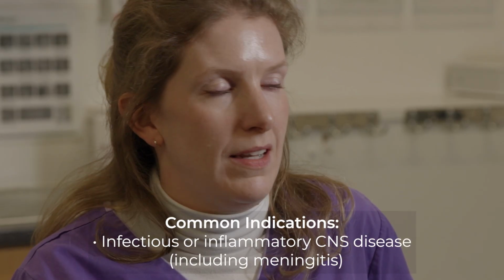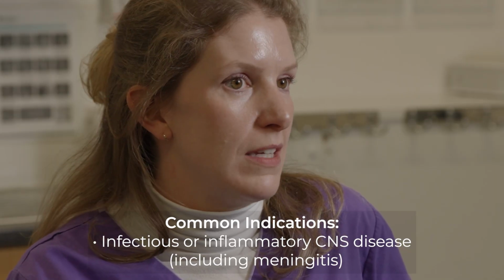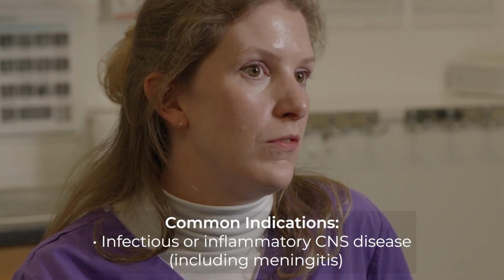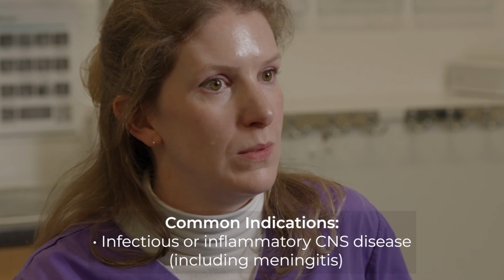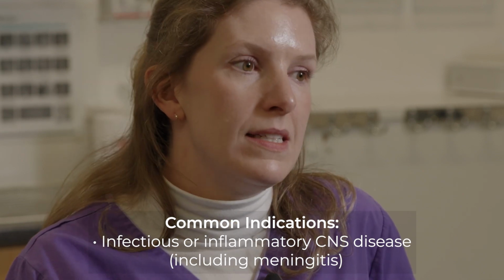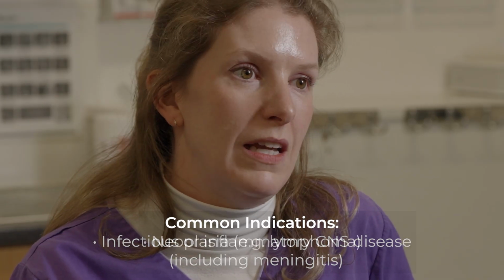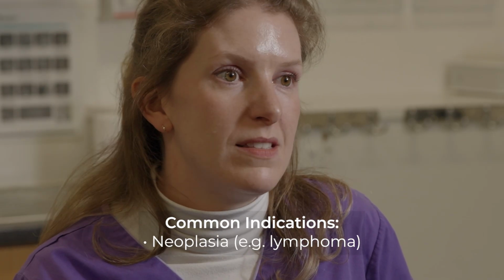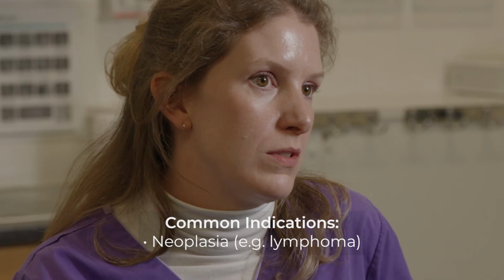Firstly, why do we take cerebrospinal fluid? So really it's for any concern I have over disease within the central nervous system. So it's particularly good for screening for inflammation and infection, whether that's within the brain, the spine, or the meninges, so meningitis. Sometimes if I have concern, particularly over cancers in the central nervous system, for example lymphoma that exfoliates its cells quite well, it can be a useful diagnostic tool.